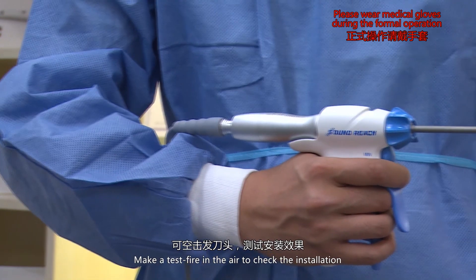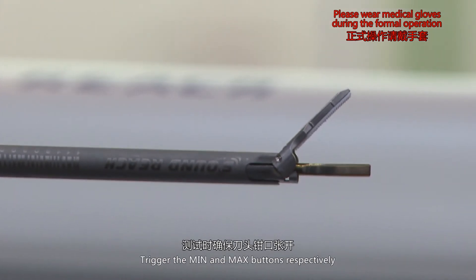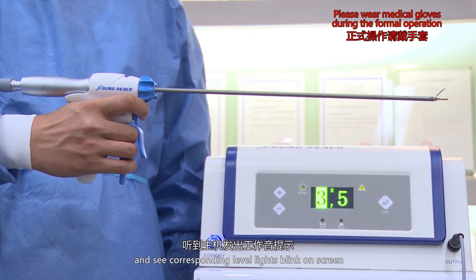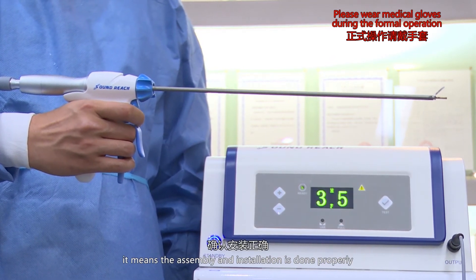Make a test fire in the air to check the installation. Keep the scalpel jaw opened when testing. Trigger the MIN and MAX buttons respectively. When you hear the notification sound and see corresponding level lights blink on screen, it means the assembly and installation is done properly.